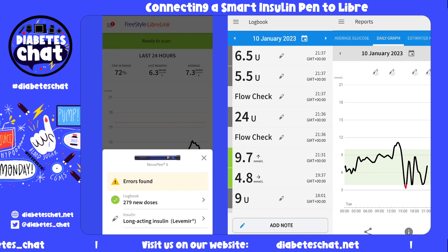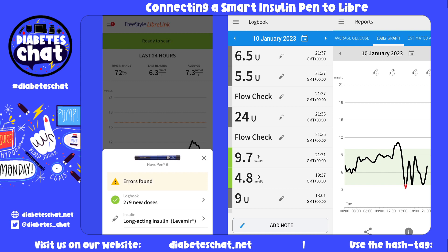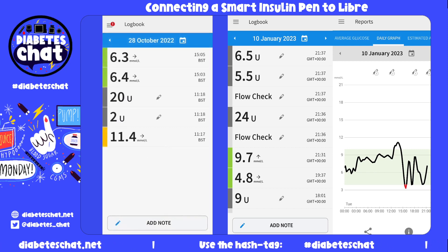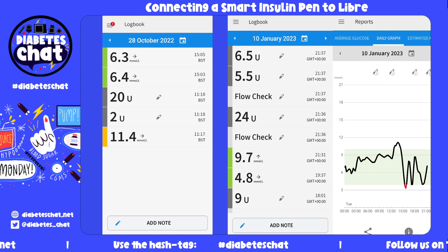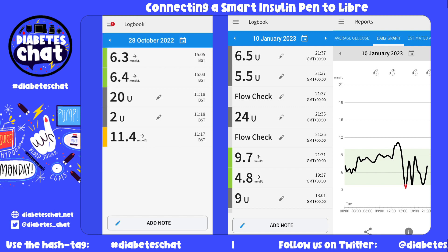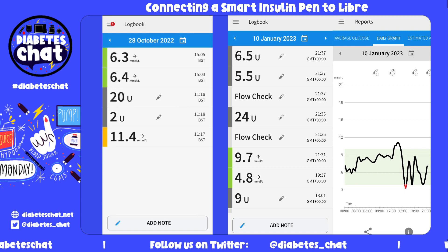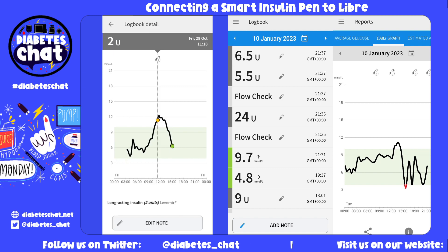I'm not sure what the errors mean, but we'll find out — maybe it's because it's the first time. I will go on the menu bar and click on it. You then see today I have done a two-unit air shot and a 20-unit insulin dose that I gave for my long-acting. Let's click into it and you can edit that note as well.